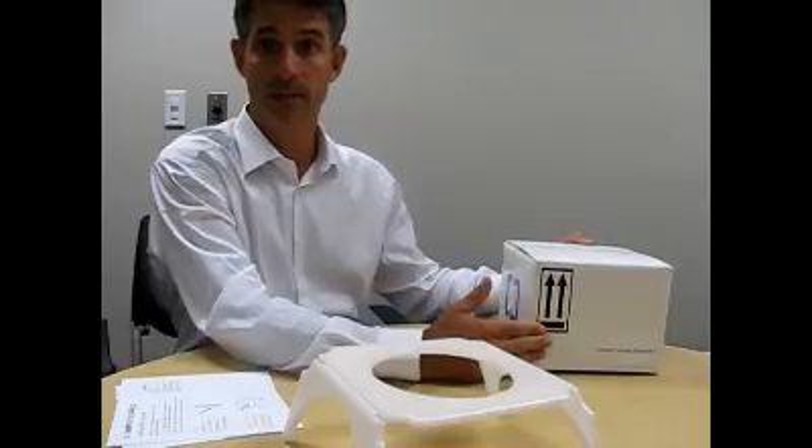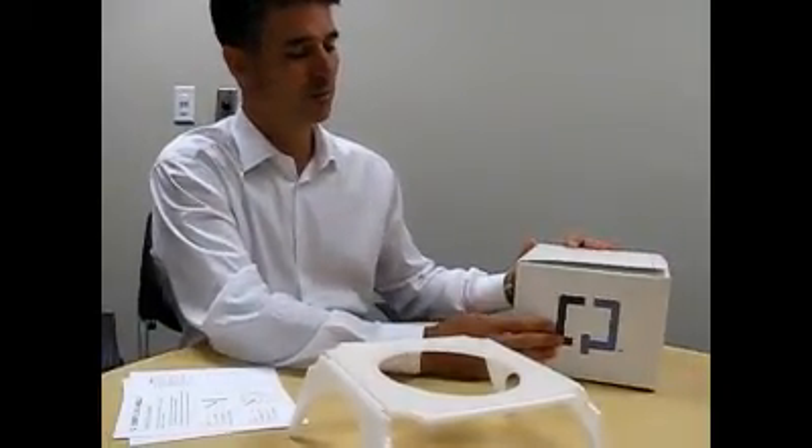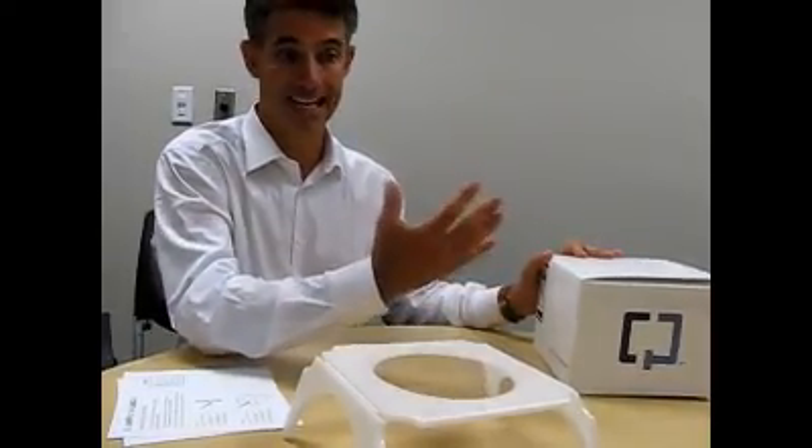This box is then shipped directly to the Exact Sciences Laboratory in Madison, Wisconsin. From there, the testing occurs. A result is generated and a lab report goes directly to the patient's physician, who is then able to call the patient and tell them the results of their colon cancer screening. It's that easy.